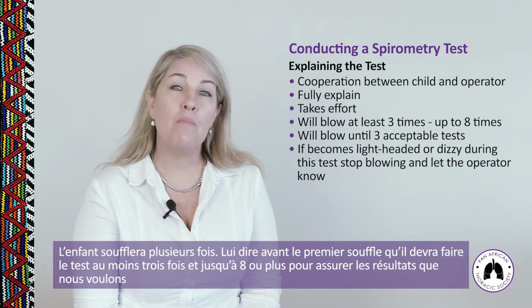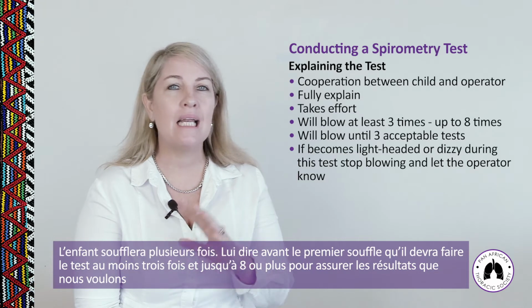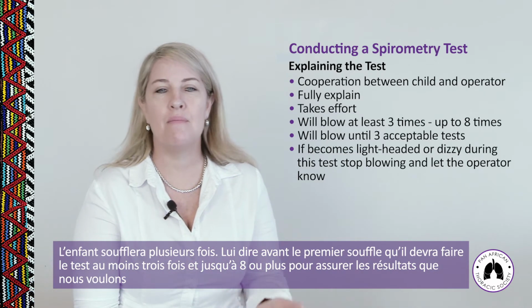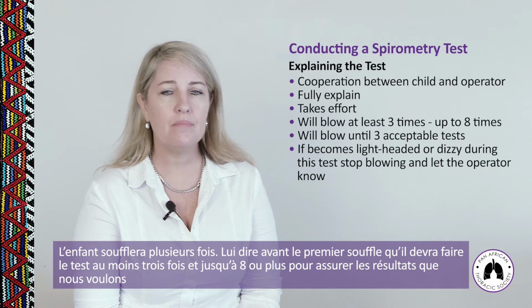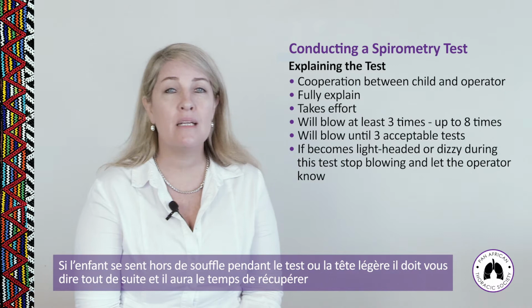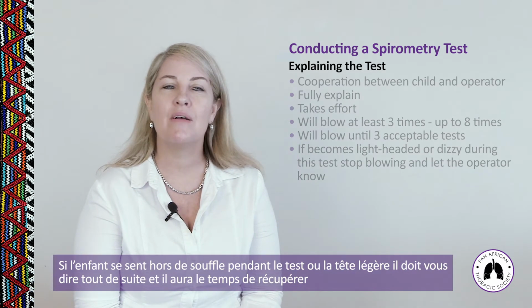The child will blow many times, so you need to explain to them before they start that they will blow at least 3 times and up to 8 or even more than 8 attempts to get the results that we actually need. But if they need a rest, you would be glad to give them a rest. If the child becomes lightheaded or dizzy during the test, they are immediately to let you know, and you will stop the test and allow them time to recover.